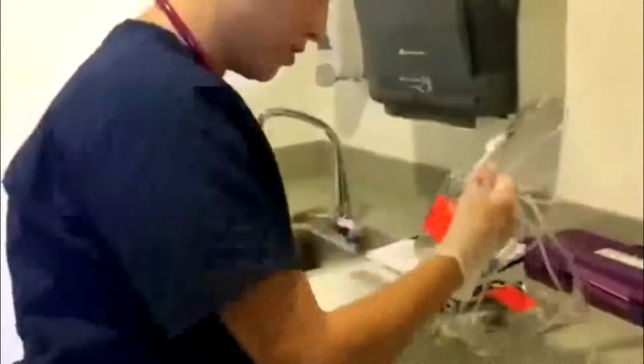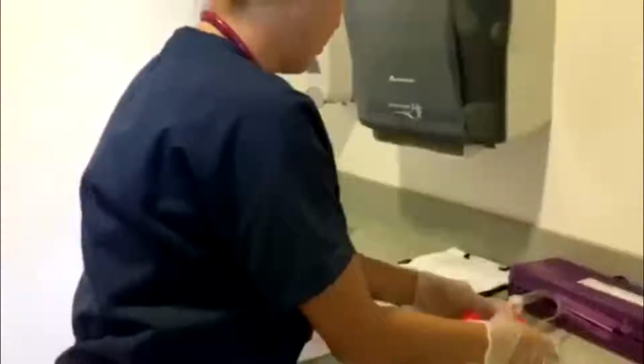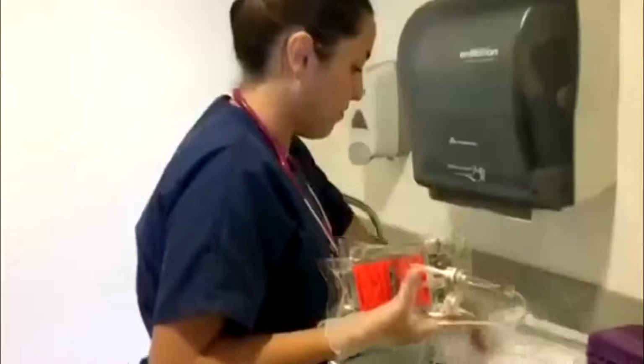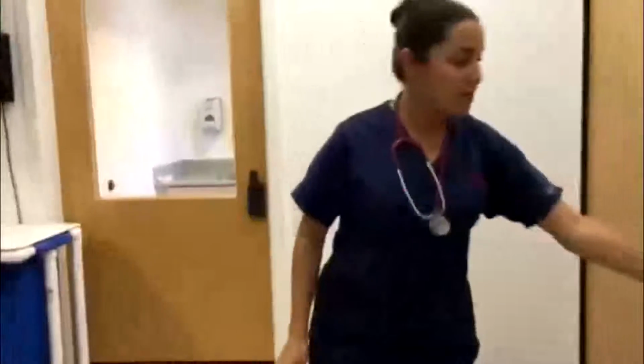Alright, so at this point, I'll take both medications into Mr. Sweetheart's room, along with the MAR and the order. Alright, I'm going to provide privacy by closing the door. Hi, Mr. Sweetheart, how are you?